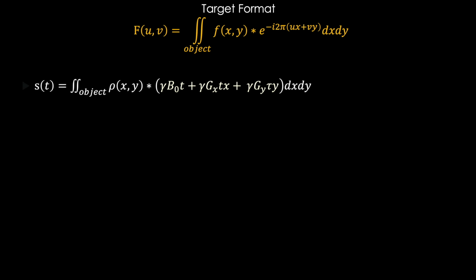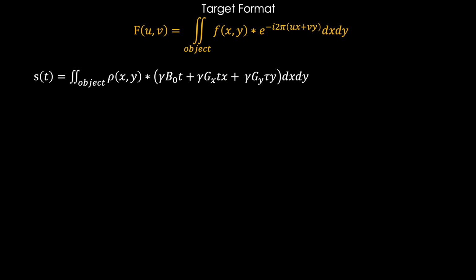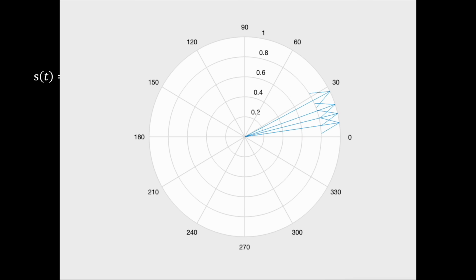So here's our formula as it stands, and notice this term we just derived is in cycles, degrees, a phase shift. Now, as some of you may remember from high school math, degrees are kind of basic. What we really want to describe is our rotating magnet's position along a circle, and in a way that works well with Fourier transforms, and it turns out we have the perfect formula for this.